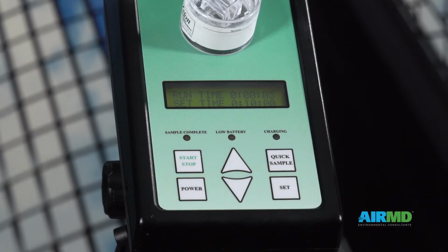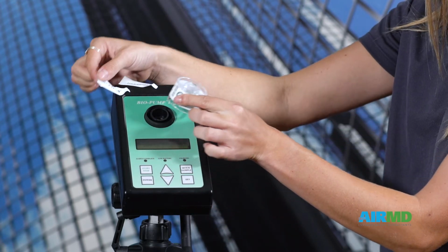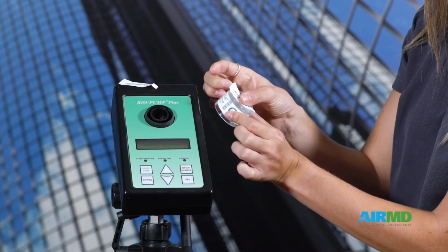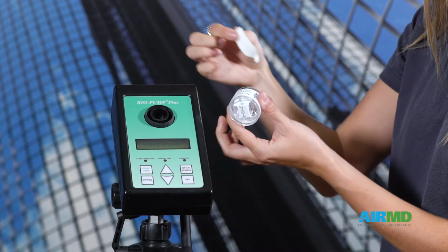After this, the sample duration is considered complete and the pump will stop sampling. A sample of 75 to 150 liters has been collected. Remove the bioaerosol cassette and replace the sticky tabs. Fold the tabs around both ends of the cassette to indicate the sample has been collected.